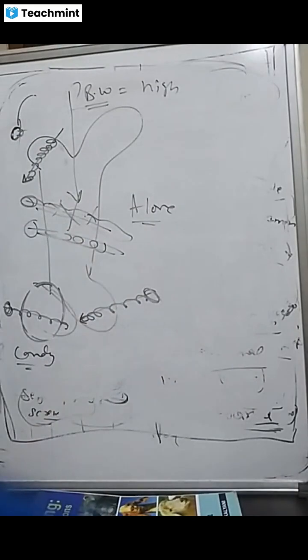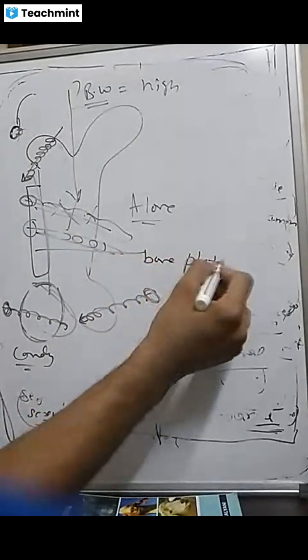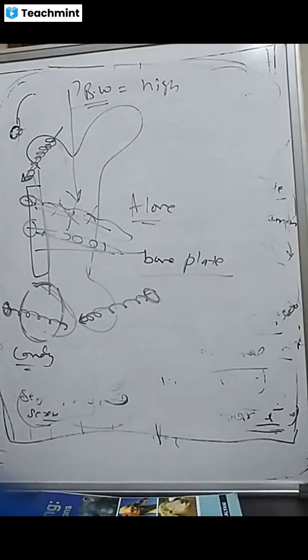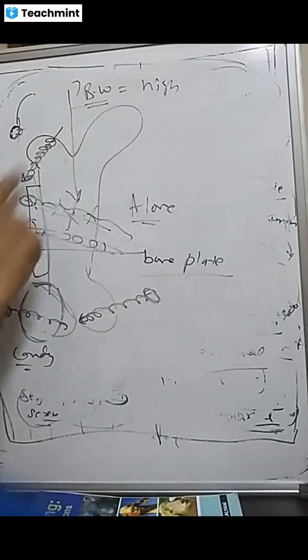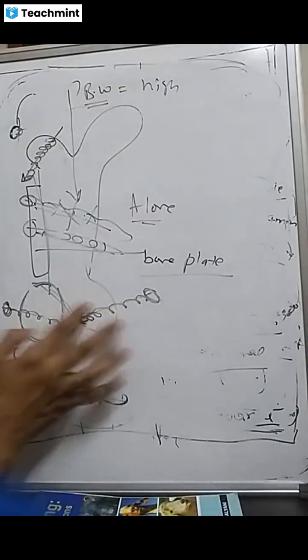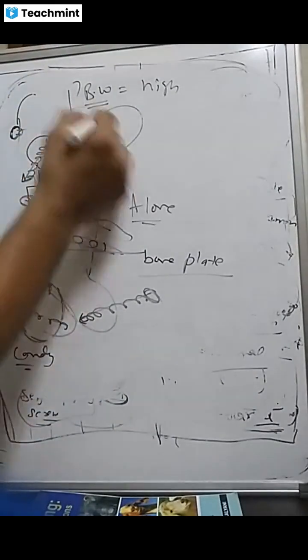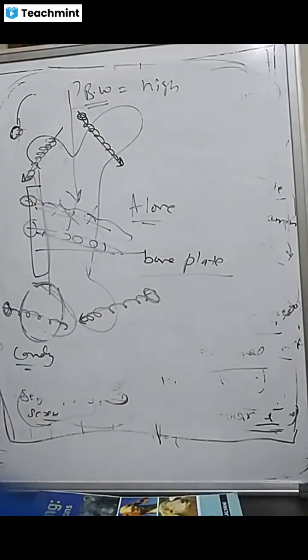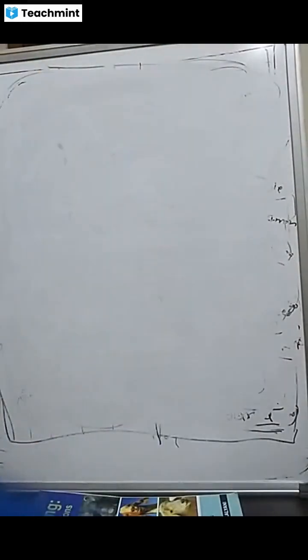So for the mid shaft, you can use a screw along with the bone plate, but a single screw alone will not help you. It can be used for small fragments and oblique fractures, like condylar fracture, like trochanter. Suppose there is a fracture of the neck of the femur, then also, for an oblique fracture, we can apply a lag screw.